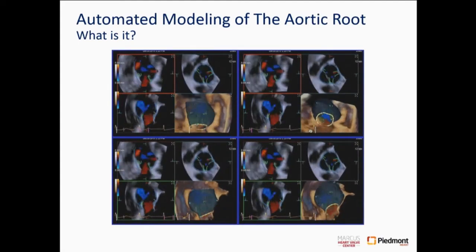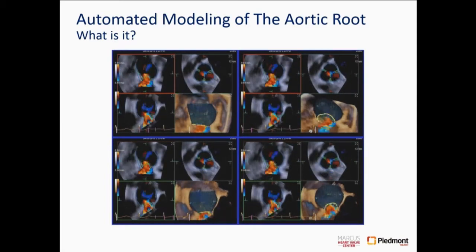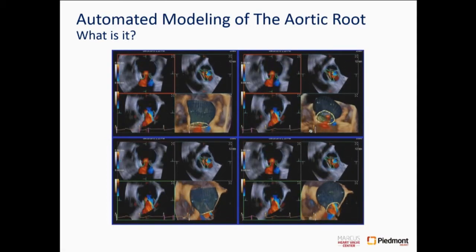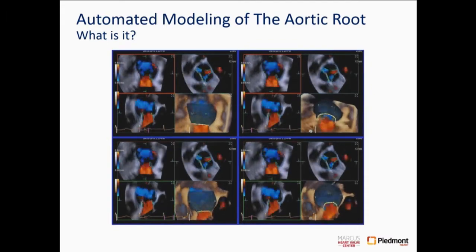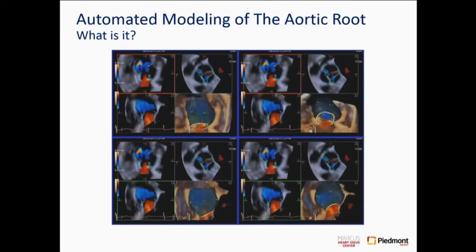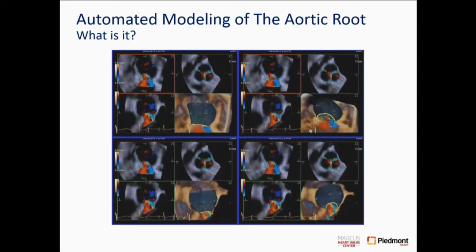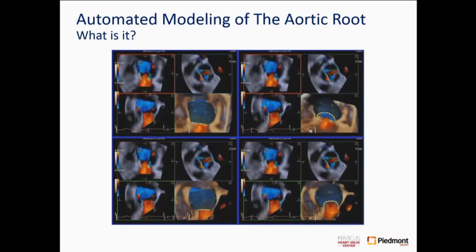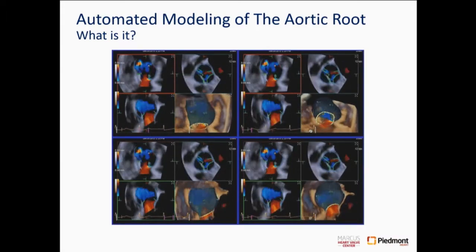So we've taken the approach that for anything to work in the clinical environment, and especially with echo and volume data, and this might actually apply to CT and MRI, although they have been in the realm of radiology for so long, and radiology is so slow to move on things. Automation has never been their thing, although they are quickly learning the art of using artificial intelligence and automation in medical imaging. So I do think one of the approaches we have taken is a completely automated approach, because for this to work in the clinical environment, automation obviously has workflow advantages.